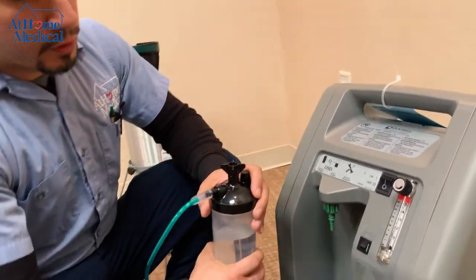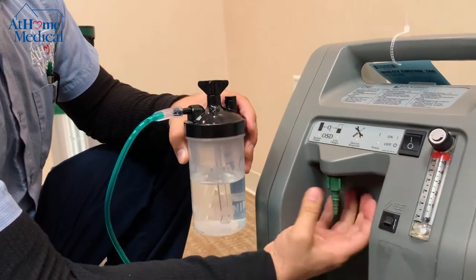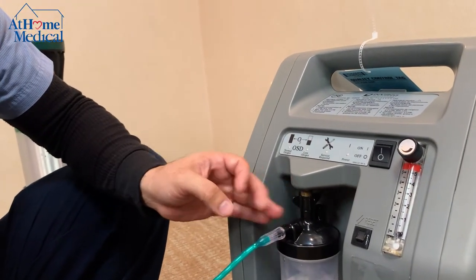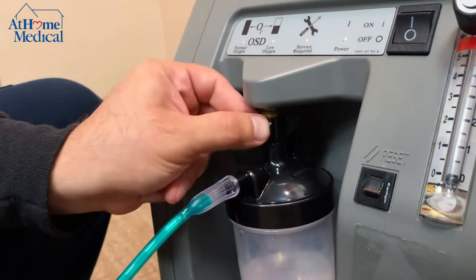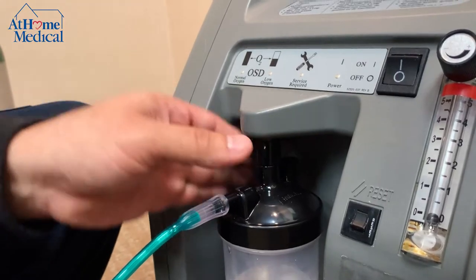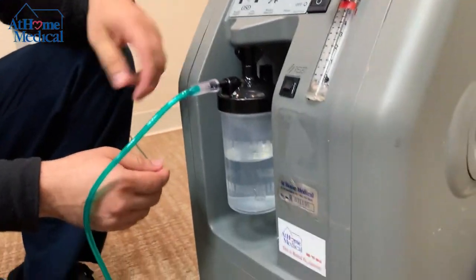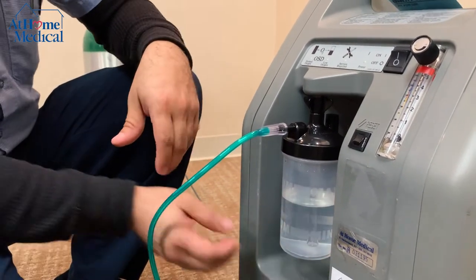If you do need to use a humidifier bottle, simply unscrew the christmas tree adapter and screw your humidifier bottle in its place. Always make sure it threads in nice and easy. If you have any problems screwing it on, it's most likely going on wrong.